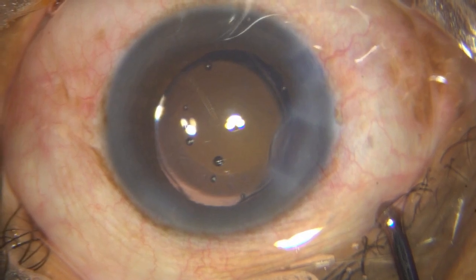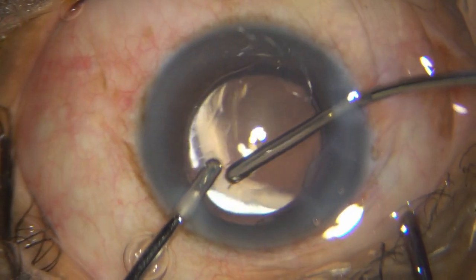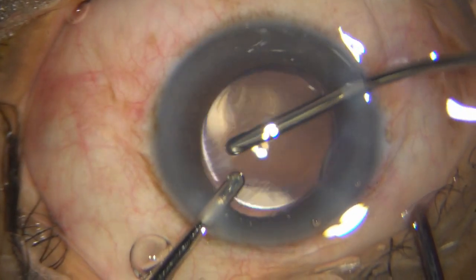And these are just the finishing touches. Remove the HPMC, put in your intracameral antibiotic, check the wounds, and you're good to conclude the surgery.